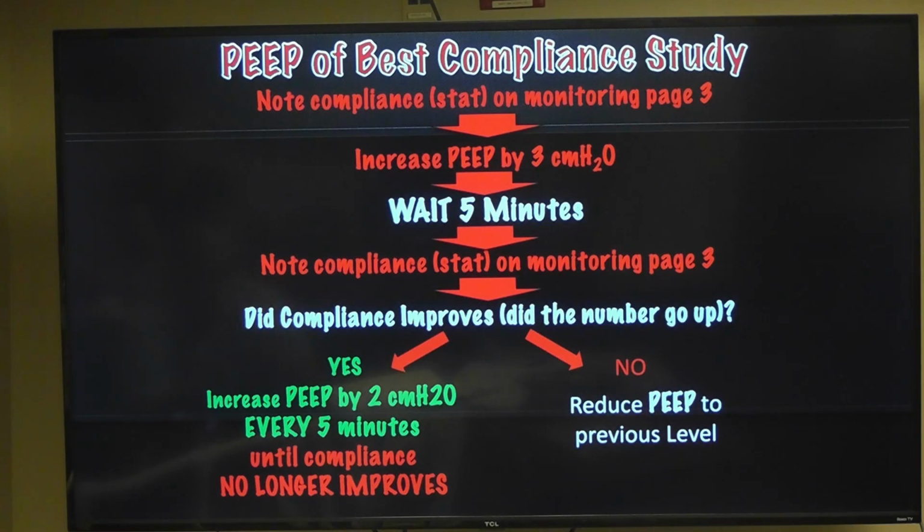Okay, who needs more PEEP? What's up? The 170 kilo, why? Body habitus. What particularly about the body habitus? They get a lot of mass on their chest, right? This is the reason that you have to sit these patients up. Sitting these patients up, right? Heavy patient, heavy chest, like large woman, pendulous breasts, there's a lot of weight on her chest, right? If you can get her set up and offload some of that, and this could be a guy too, you offload some of that, that's going to go a huge way.